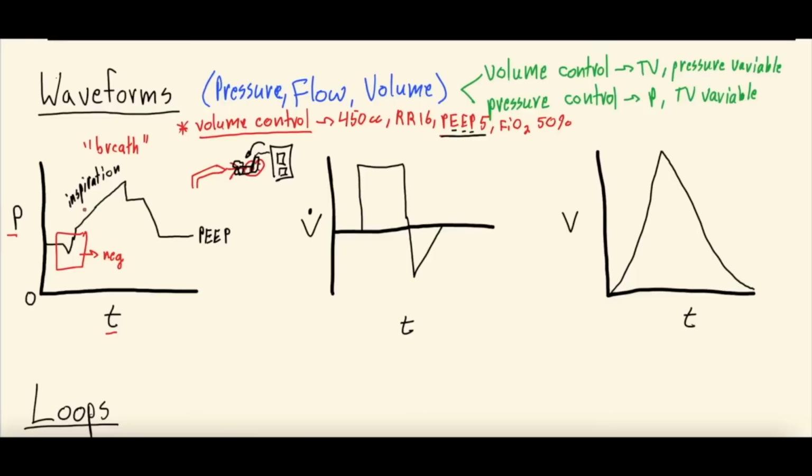It increases, increases, increases to a point, and this top pressure here is going to be known as the PIP, or the peak inspiratory pressure, the highest pressure that is seen in the circuit when that volume is given. And the peak inspiratory pressure is usually a surrogate for airway resistance, because it's the pressure that is seen in this circuit when they're pushing the breath in. So if you have a lot of bronchoconstriction, or the ET tube's got a clog, or there's a lot of mucus, there's more resistance when you push that breath in, so this PIP might be higher.